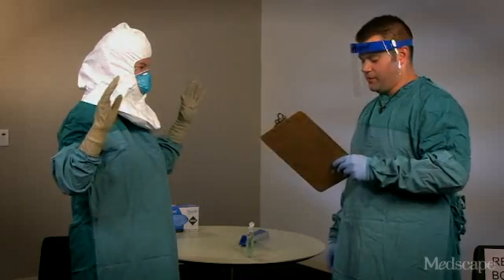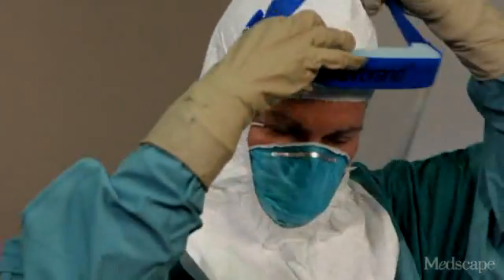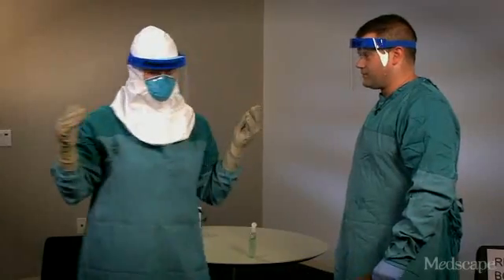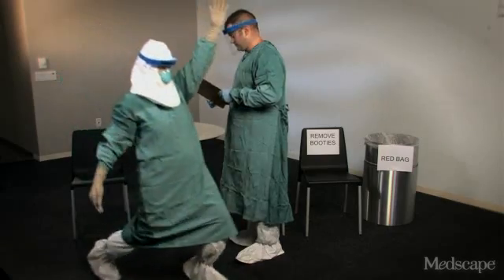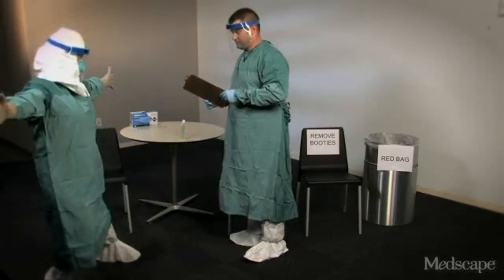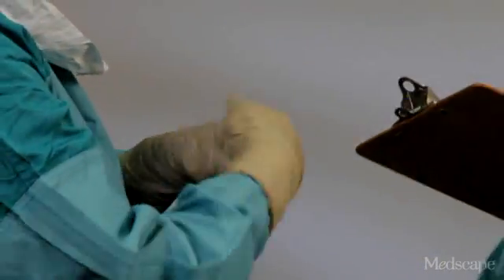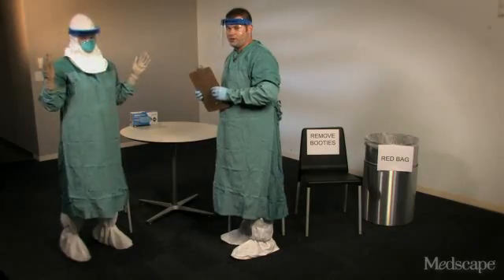The last item Barbara is going to put on is a face shield to protect the front and sides of her face. Now Barbara is going to turn around so I can inspect her and also go through a range of motions to make sure she can move freely and comfortably. I'm also going to make sure that all areas of the body are covered. Now before Barbara goes to see a patient, we're going to disinfect her hands.